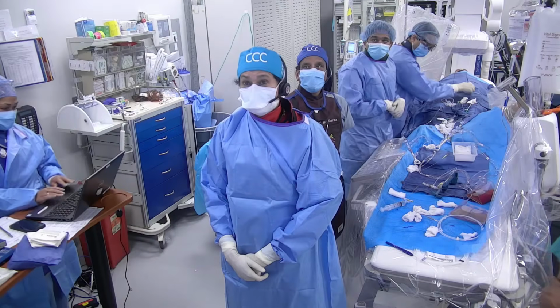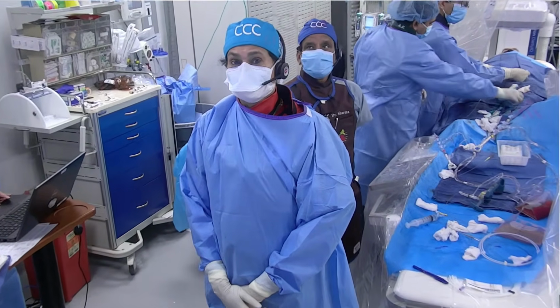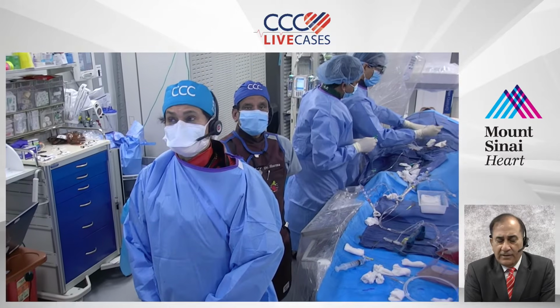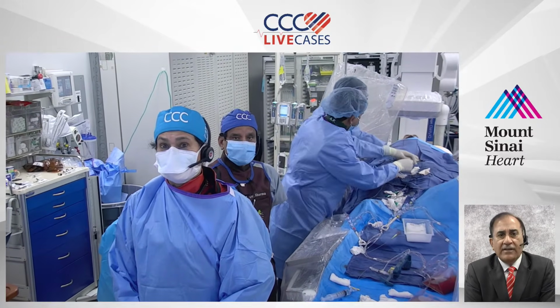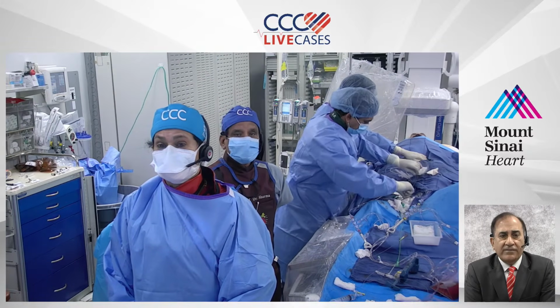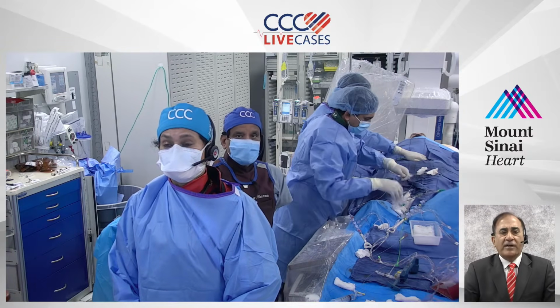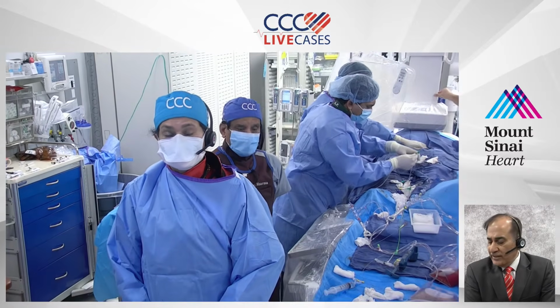Anu and Samin, I think many lessons have been learned today, particularly the description of the wires is absolutely fantastic. You were both very persistent. I think the patient was given absolutely the finest effort. The plans for the future are right on, and hopefully we'll be able to watch this case in the future. We finish here, and we'll see you on March 15 for our next session. Thank you.